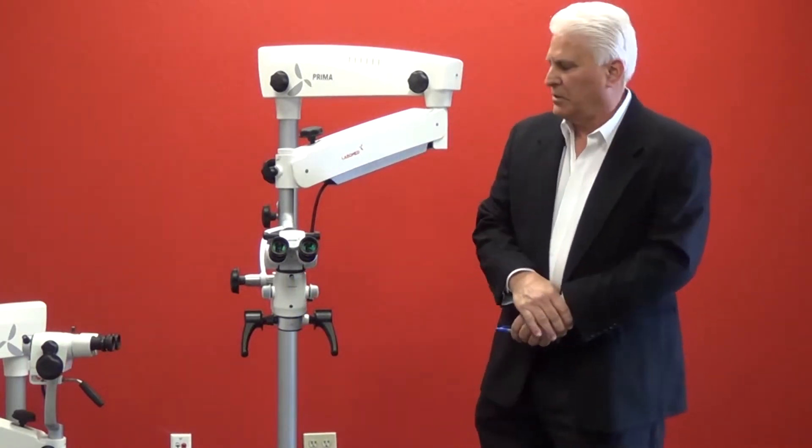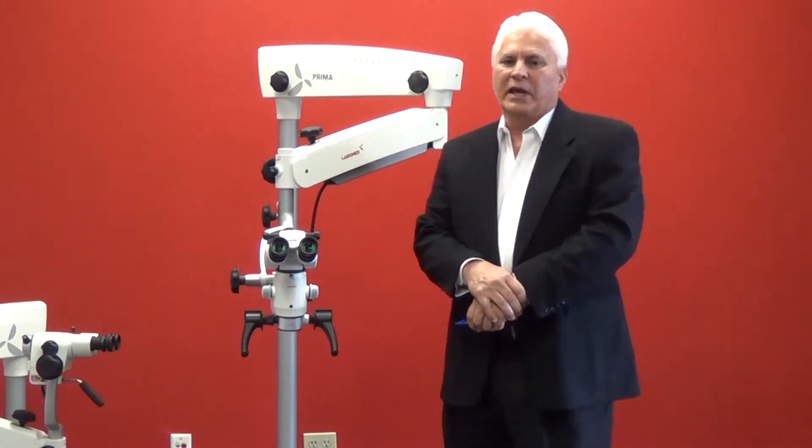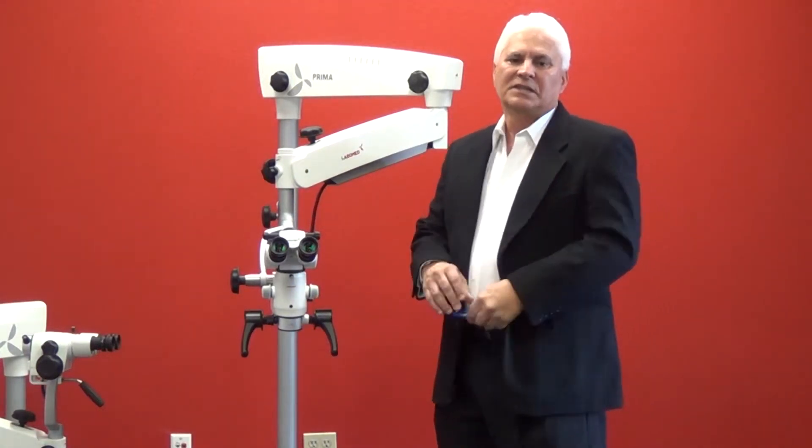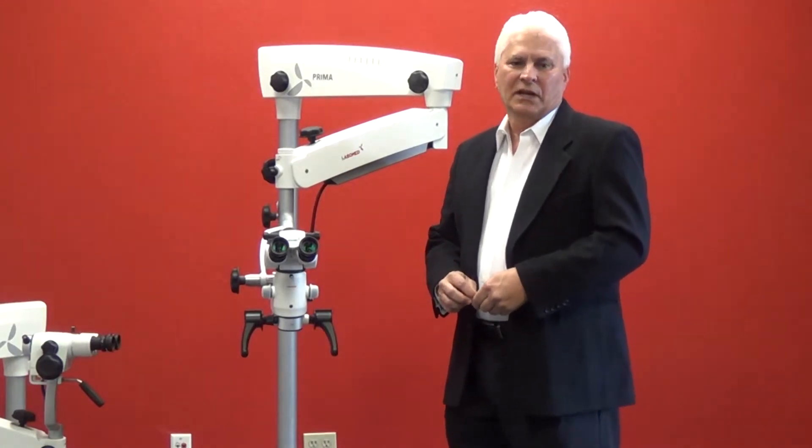For a colposcope, the head type is straight as standard and can be offered with a 45 degree angle as well, given the seated position of the patient in relation to the doctor.